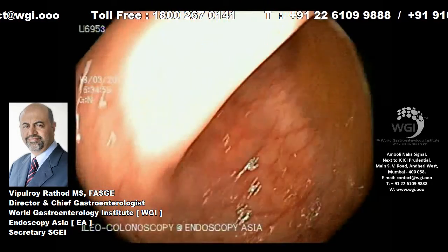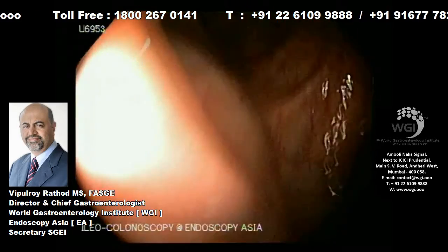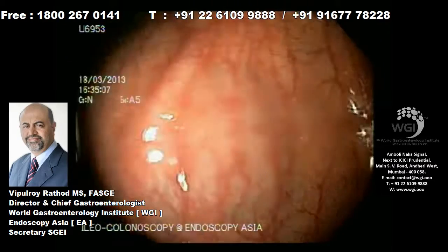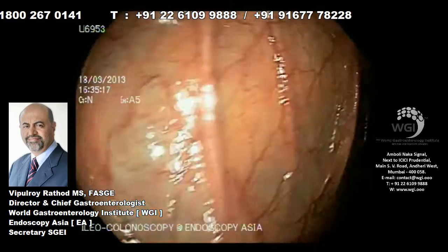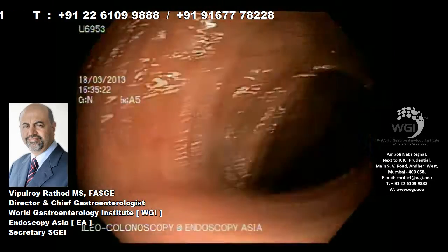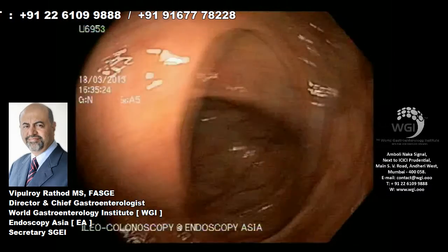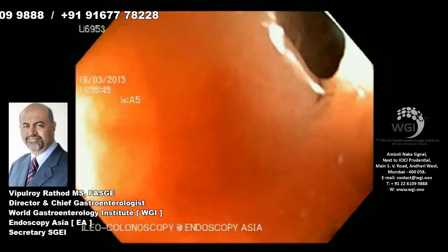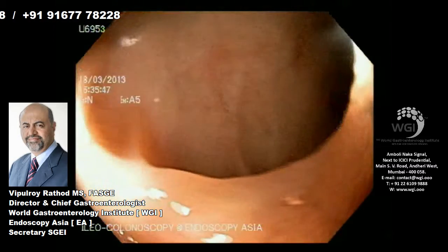Once again, there is no obvious pathology surrounding this, hence we continue our hunt for the iron deficiency anemia noted in this elderly lady. Over here you see a bluish hue, which could signify either the splenic or the liver shadows, which would appear as a bluish hue and signify where you are.